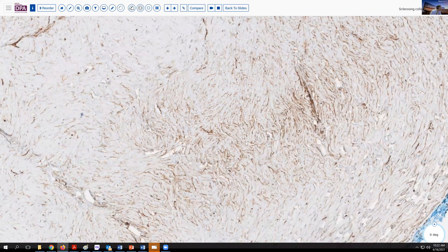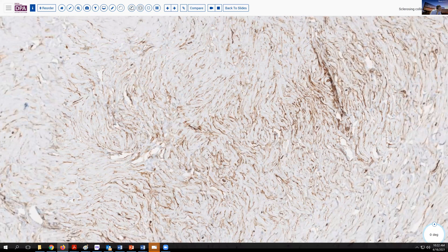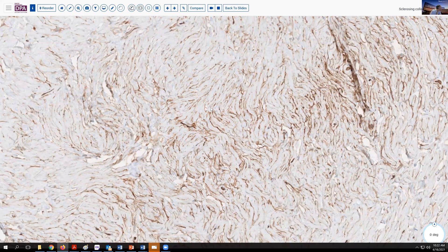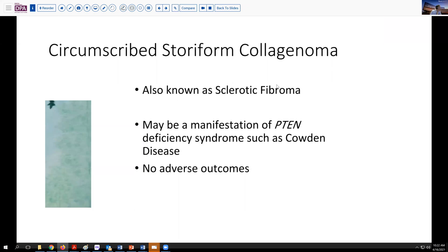So is this a solitary fibrous tumor or something related to that? It certainly comes into the differential considerations when looking at this wiry collagenous matrix. But in fact, that's probably not the preferred diagnosis in this situation. This is what's been called a circumscribed storiform collagenoma, also known as a sclerotic fibroma.